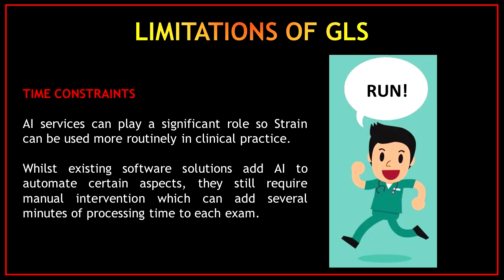Another limitation is time constraints. Artificial intelligence services can play a significant role so strain can be used more routinely in clinical practice. Whilst existing software solutions add artificial intelligence to automate certain aspects, they still require manual intervention, which can add several minutes of processing time to each exam.